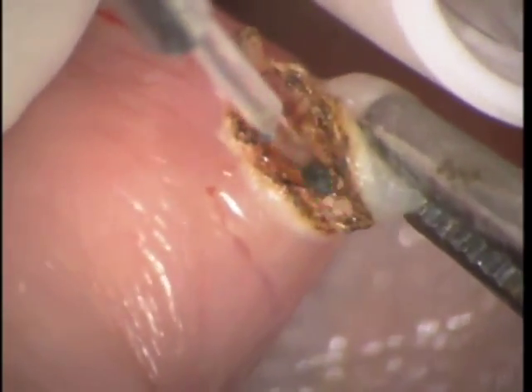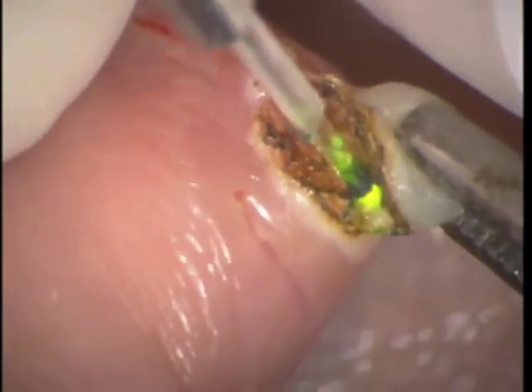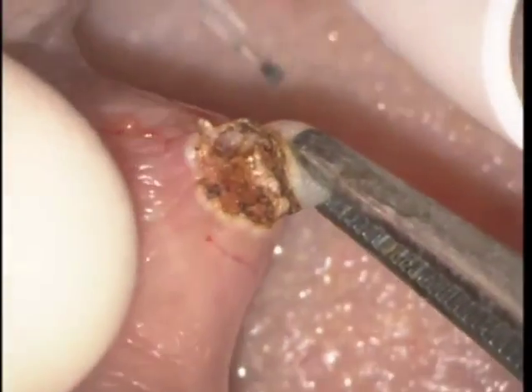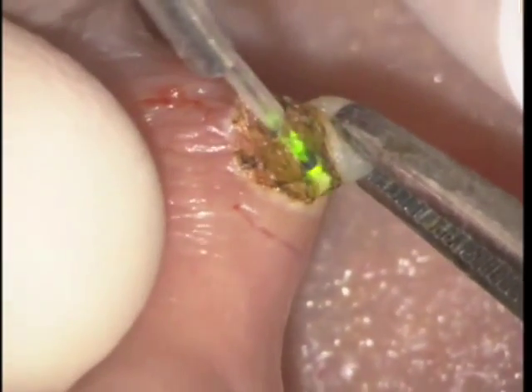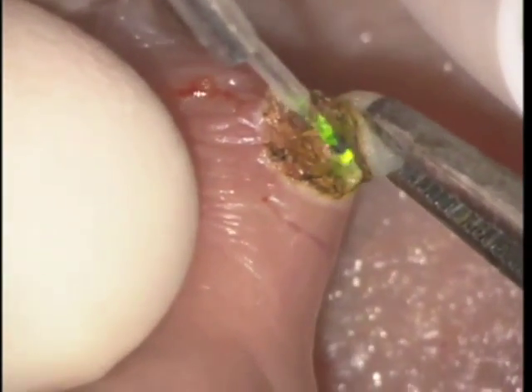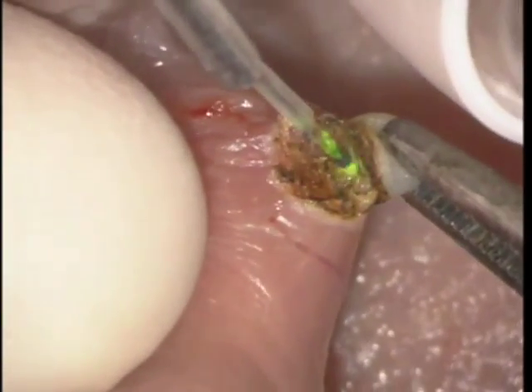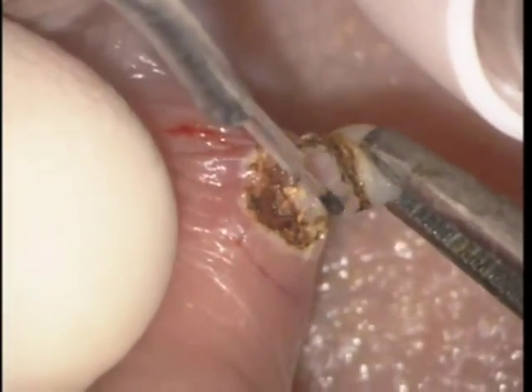As we distend the lesion further and further and work our way through, you can start to work from the other side if you wish, but sometimes you can miss your initial cut, so I prefer to just work from one side. Here we're almost through — it's taken us about 90 seconds to cut through — and at this point you're distending, pulling, and slowly working the laser back and forth to remove the last fibers.